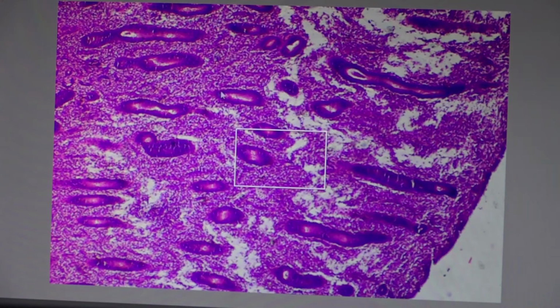This slide is a microscopical section of endometrium, thick endometrium. This thickness of the endometrium may exceed 2 cm. Normal thickness of the endometrium is less than 0.6, 0.7, rarely 0.8, but in some conditions there is an increase in the thickness due to hyperplasia. This hyperplastic change results in bleeding and histologically is composed of benign-looking glandular epithelium, with scanty stromal tissue.